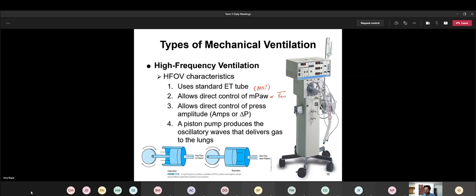Now, of course, they started with the A model first, and then they went back and did the B model. But they still have both available. So sometimes hospitals will have, I've seen this happen before, nothing but 3100A models in the nursery. And then if they were going to be using this on an adult every once in a while, they would have a couple of the B models as well. That way the adult ICUs could have it.